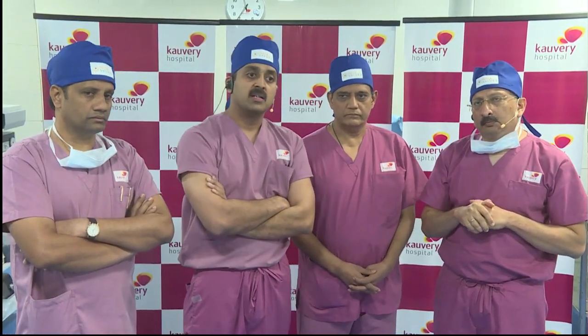I think this was something very unique, which we did today without any contrast. And as you saw, using this self-expanding retrievable valve was the key to success in this kind of situation. And of course, taking the help of TEE in this particular case was quite useful, and we were able to reposition the valve very successfully three times, and the valve was in good position. It just goes to show the advantage of the retrievable system, because I don't think any other system would be appropriate. It also goes to show that you didn't need the second pigtail.